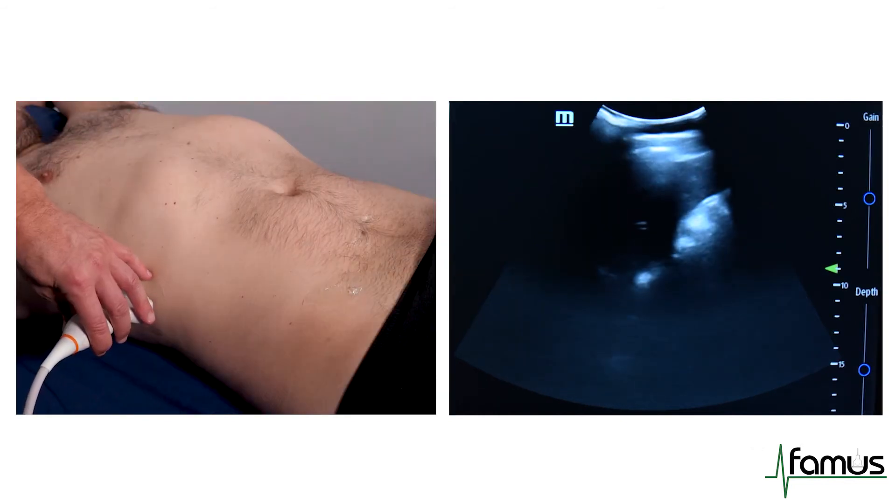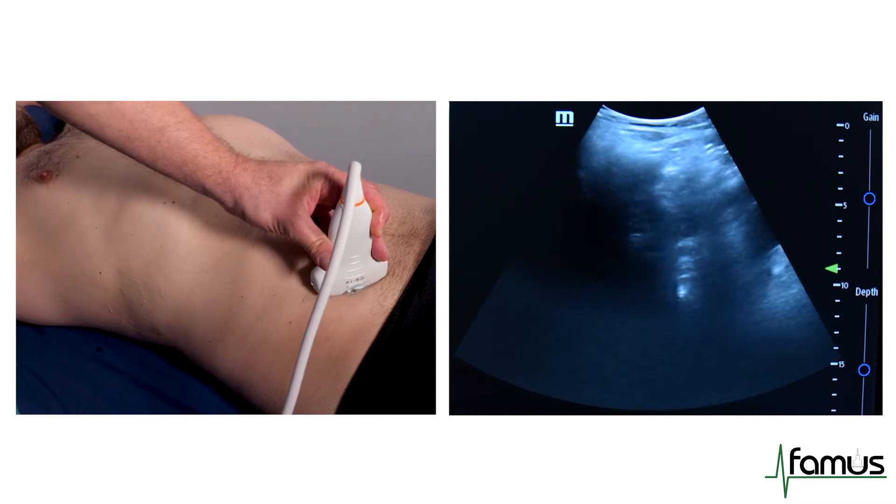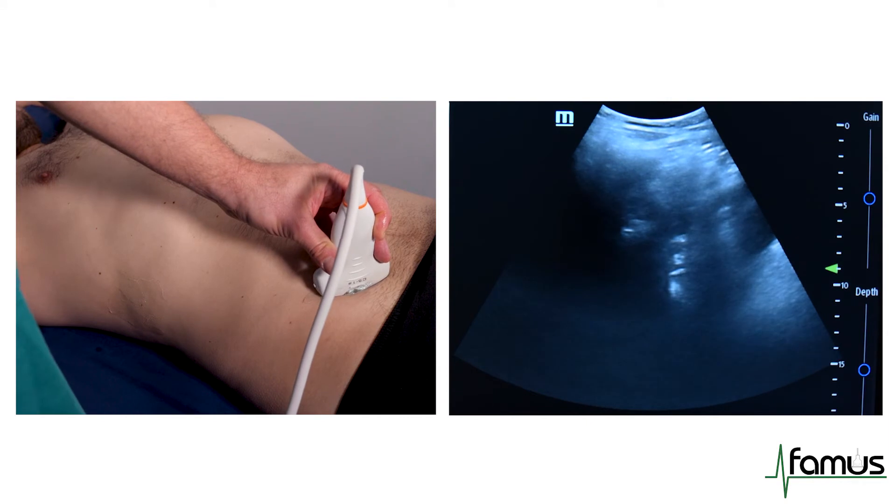We will then move our probe into the right iliac fossa with the marker dot towards the head and towards the right hand side, and we will check for free fluid. In this case, there is no free fluid.